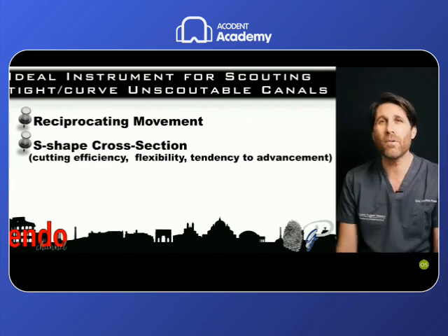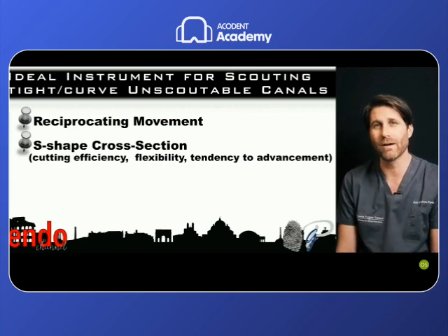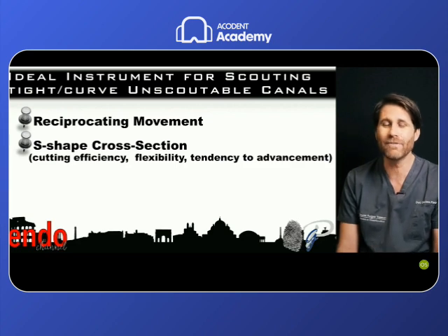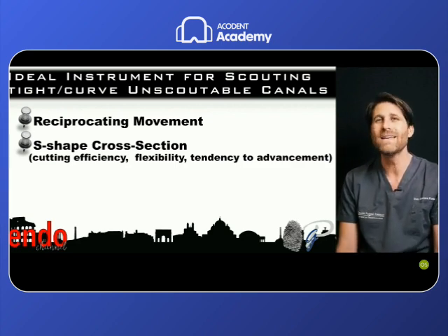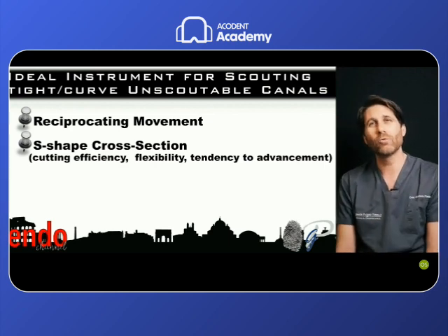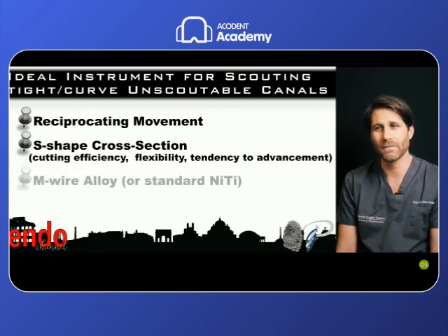That is very important if we want to scout an unscoutable root canal, especially in the apical third. The self-advancement, the auto-progression, is a mandatory property to follow a natural path that is not scoutable, thanks to the mechanical file and its characteristics.